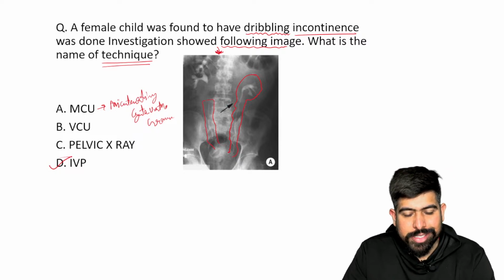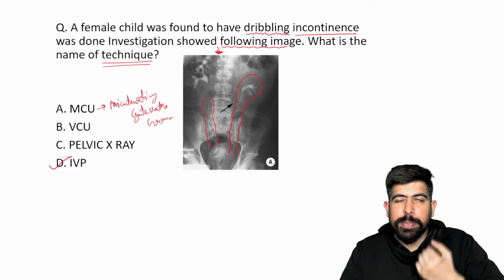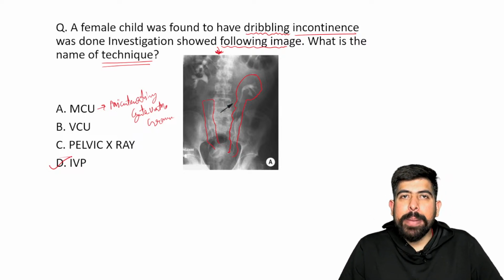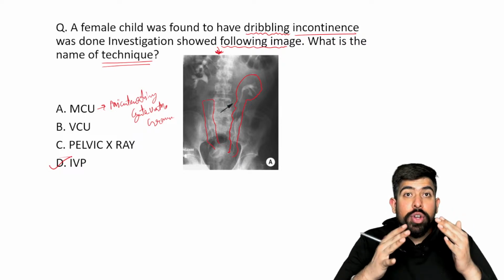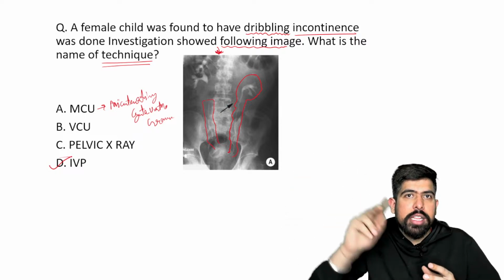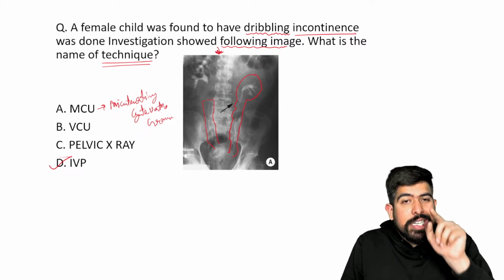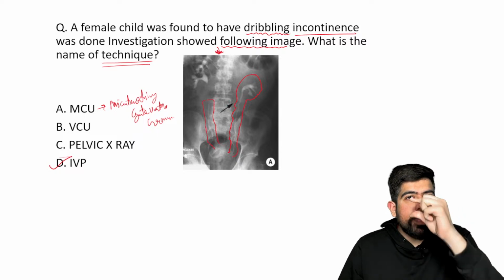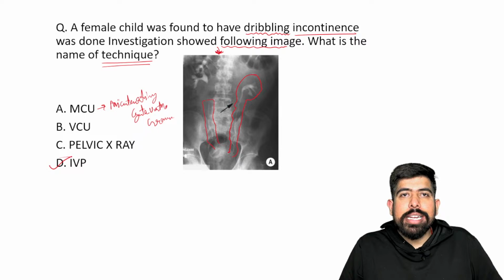So what we are doing in this condition, we are putting a catheter inside the patient's bladder, and we are putting the contrast material in the patient's bladder. So the patient's bladder is fully filled with the contrast material. We are not looking at the kidneys or the ureters. Please remember, retrogradely the contrast will not go to the kidneys. But the image I showed you, is it clearly showing the kidneys and the ureters? Please be clear about it. So this all will be inside your bladder.